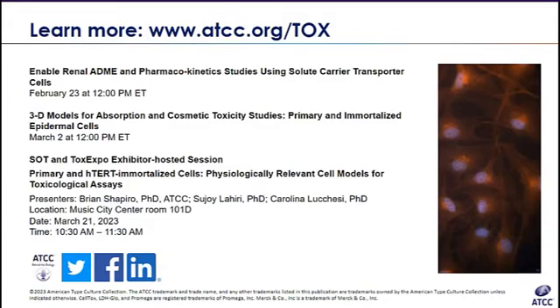So again, our hTERT cells, I know that we test them out for at least 35 PDLs, but we've routinely cultured them way beyond that, something like 250 population doublings, and we've shown that they will show no loss or change of performance, so they'll still stay the same. So you can keep these things for quite some time.